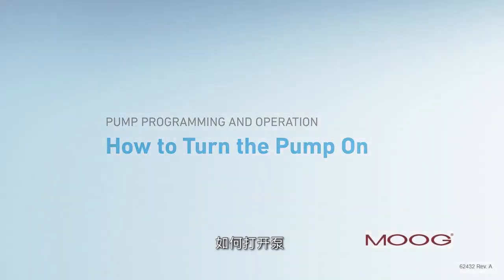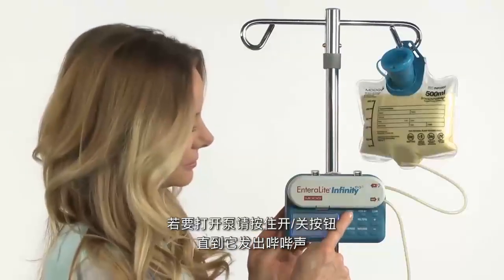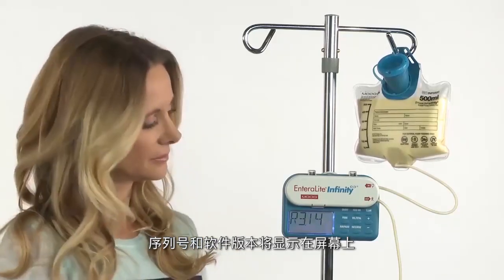How to turn the pump on. To turn the pump on, hold the on-off button down until it beeps. The serial number and the software version will be displayed on the screen.